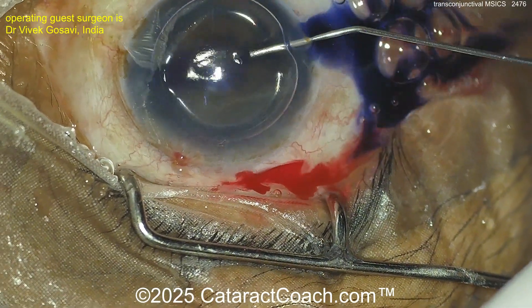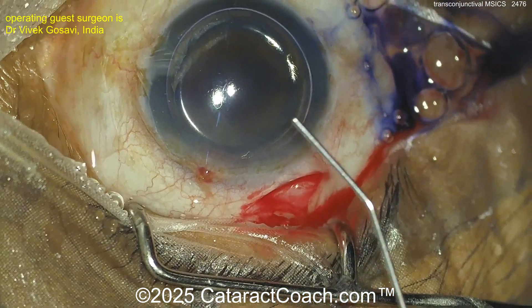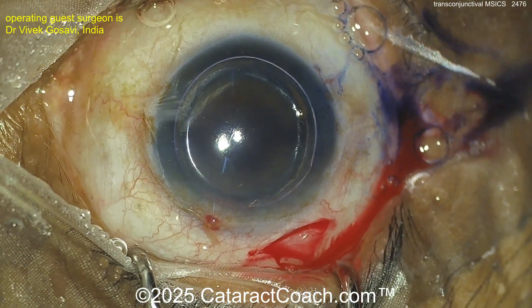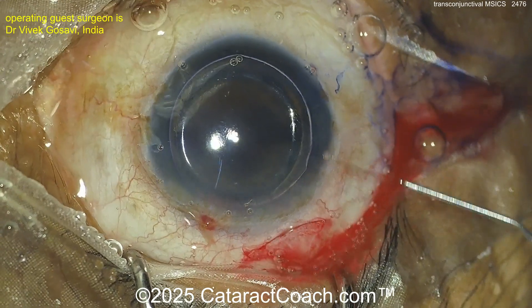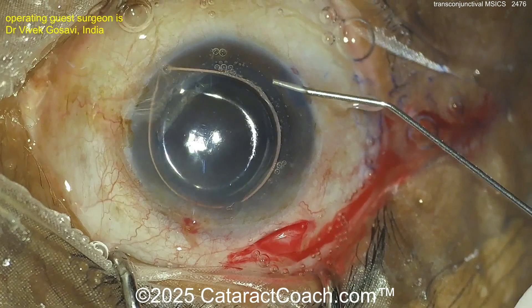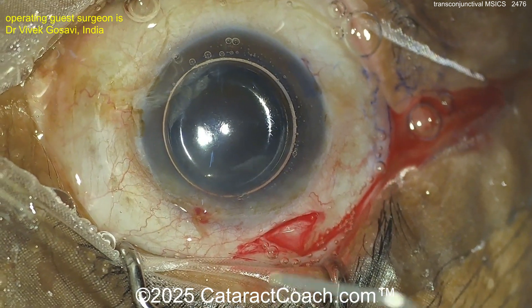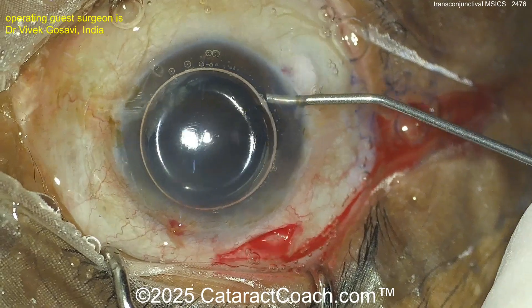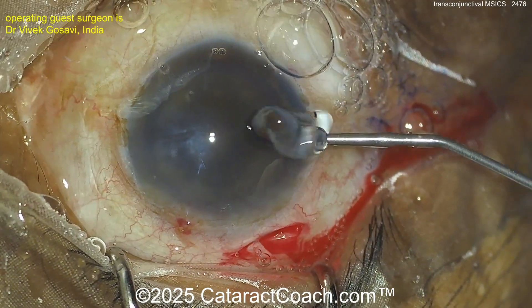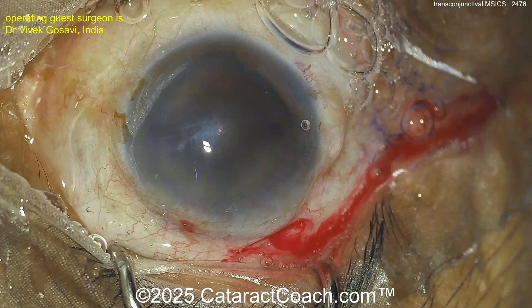A little bit of trypan blue dye going in, and now let's get viscoelastic, and then a rhexis is being done. The question is: at the end of the case, will the surgeon still do this all sutureless? I guess you can. Let's see the rhexis — remember it needs to be pretty big in these eyes. There we go, good viscoelastic going inside.